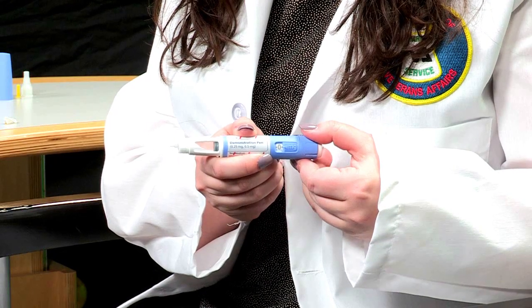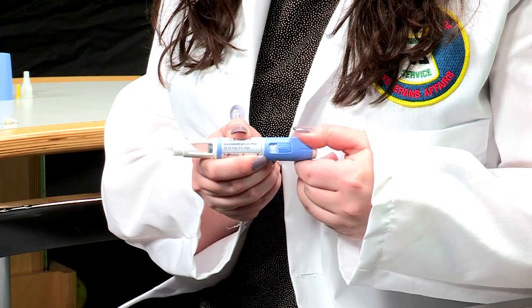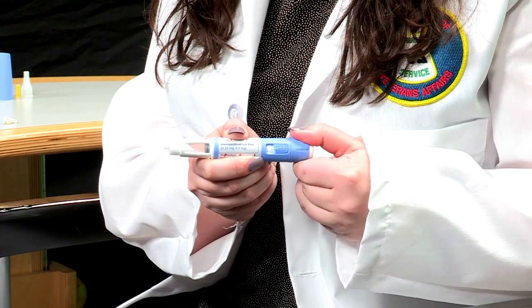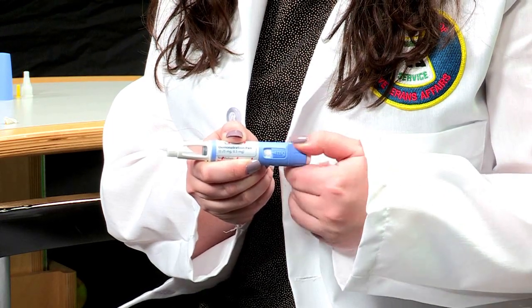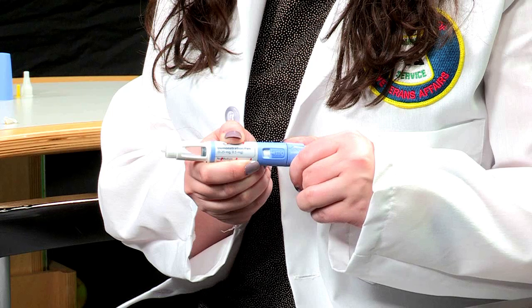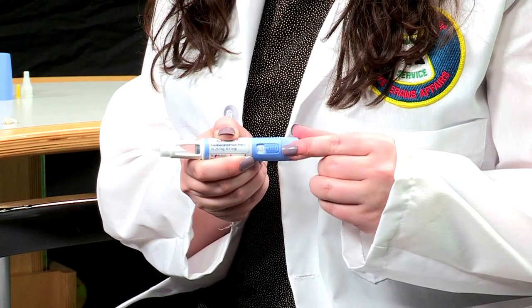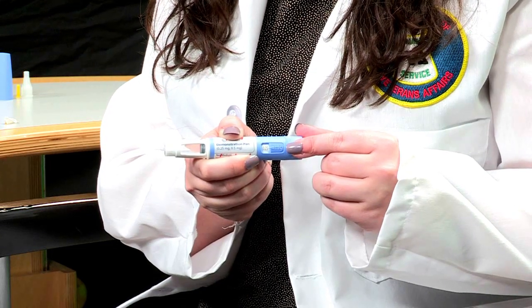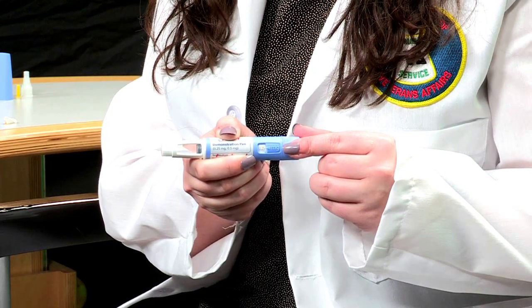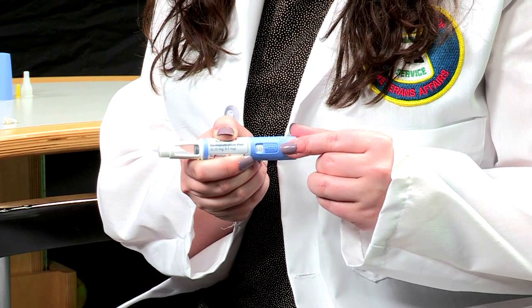Next, you will need to turn the dose selector until it shows your prescribed dose. Make sure the dose lines up exactly with the dose pointer. If you pass the dose you are supposed to take, it is okay to move the selector backwards or forwards to find your correct dose. You will hear a click with each turn of the dose selector.